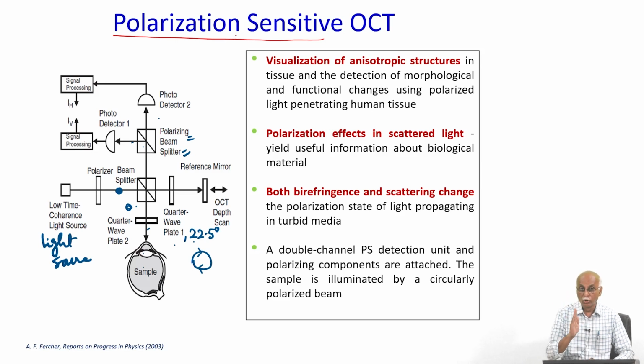Let us say I divide this light into horizontally polarized and vertically polarized light.